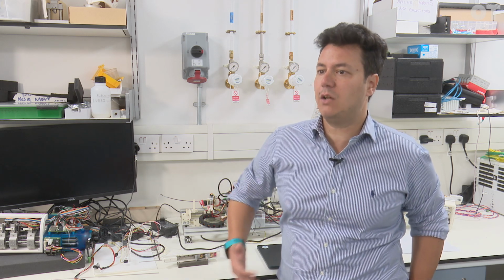So the retina of the human eye is as thick as the human hair. And ultimately, these therapies would need to be deployed inside that hair-thin structure, so at the specific layers of the retina. And that cannot be done by the human hand, and it cannot be done by the human eye. So we are developing technology to improve surgical dexterity and improve surgical perception and cognition.